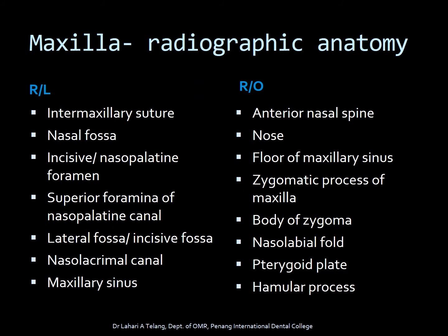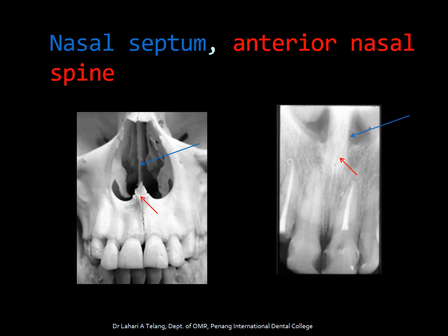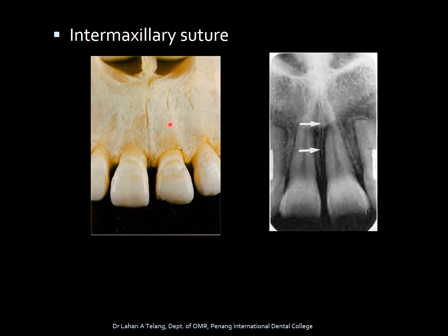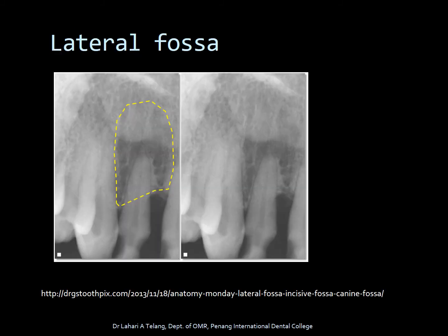Moving on, let's look at radiographic anatomy in the maxilla, with various radiolucent and radiopaque landmarks. The nasal septum is a thin bone, and the anterior nasal spine is a triangular or diamond-shaped radiopaque area. The nasopalatine foramen — where the nasopalatine canal exits on the anterior maxilla — appears as a radiolucent area. The intermaxillary suture, where both halves of the maxilla join, is apparent as a radiolucent line on the anterior maxillary radiograph. The lateral fossa is a small depression in the lateral incisor area caused by less bone density near the lateral incisor.